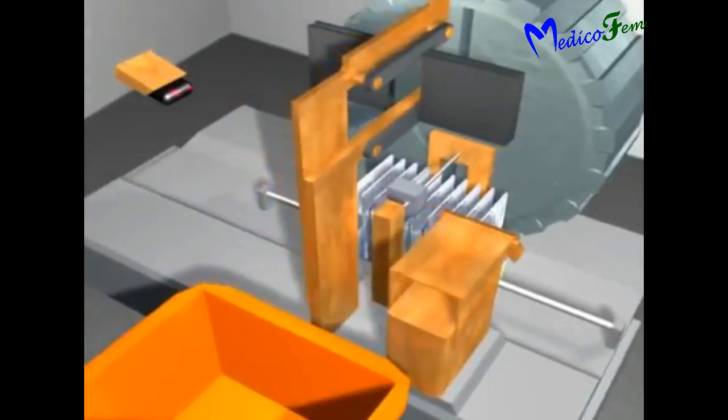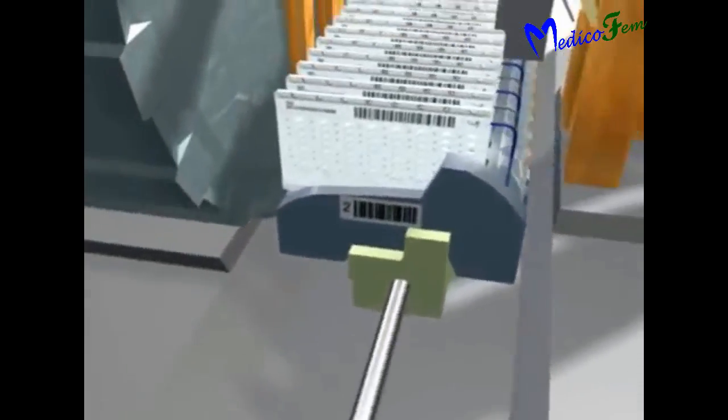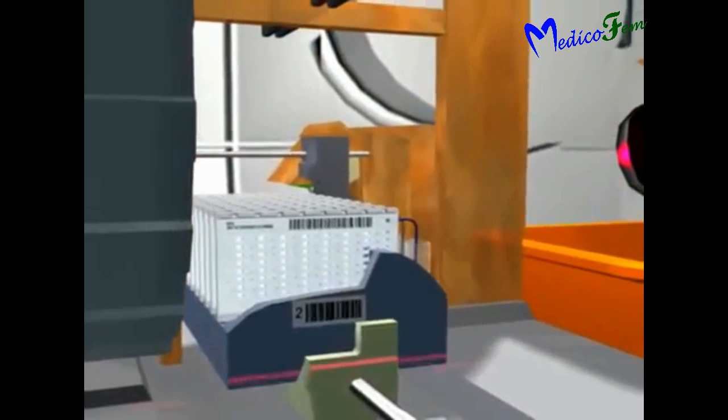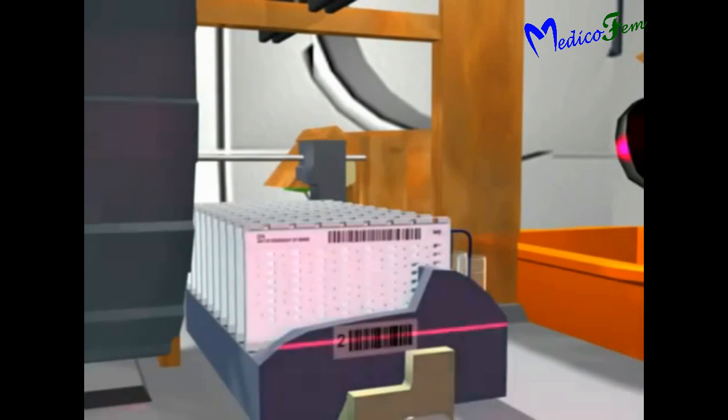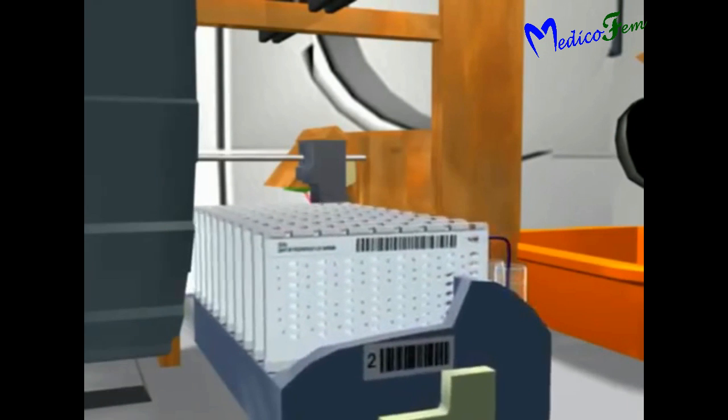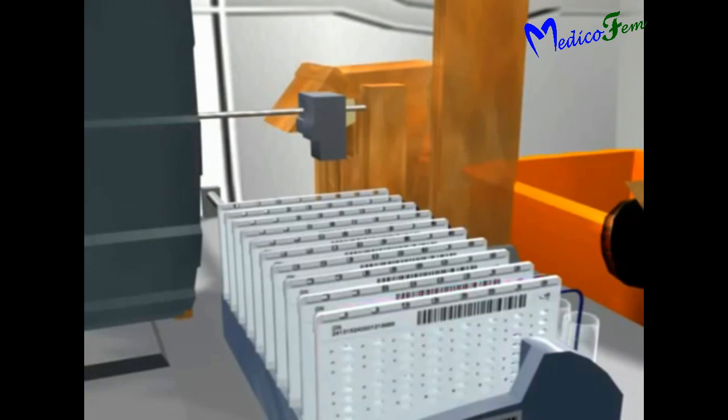In the incubator chamber, first one scanner will scan the load code. Then that scanner will scan the code of each card. One heated cutter will cut and seal all the tubes of each card.